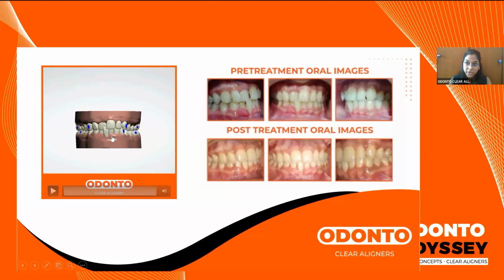It is a predictable movement that we see. And for that, this will again be in your mild category. So it will take you less than 20-25 sets to receive correction completely. Some small amount of proximal reduction will be required in these cases to relieve these contacts so that we are able to have smooth movement of the teeth as we are progressing through.